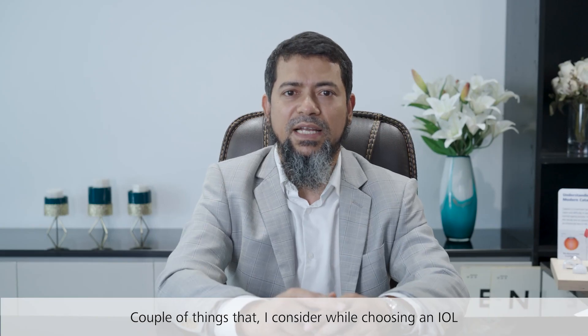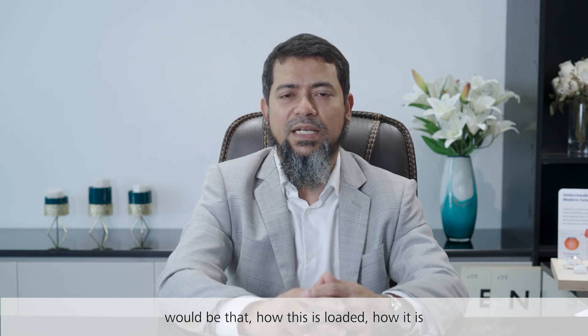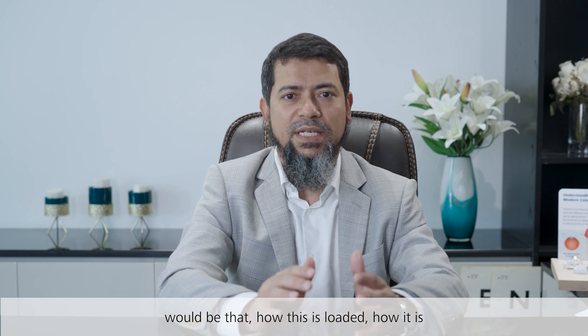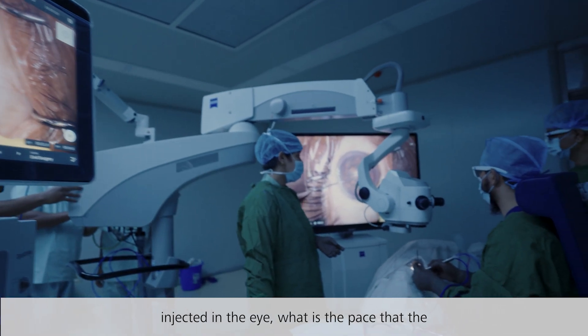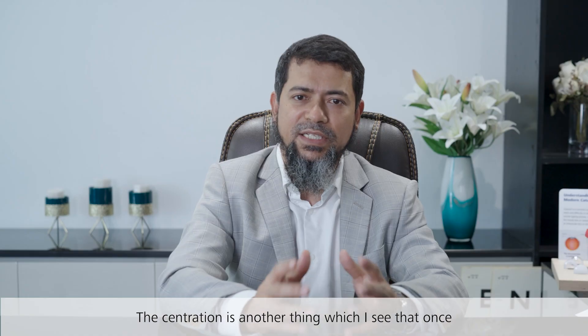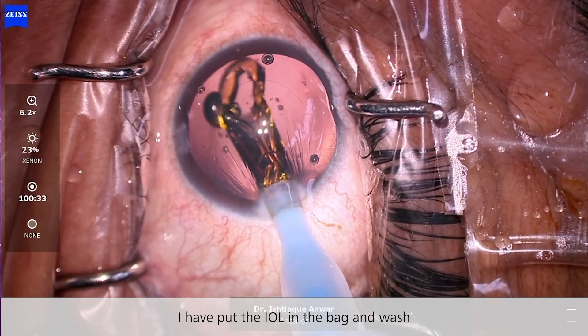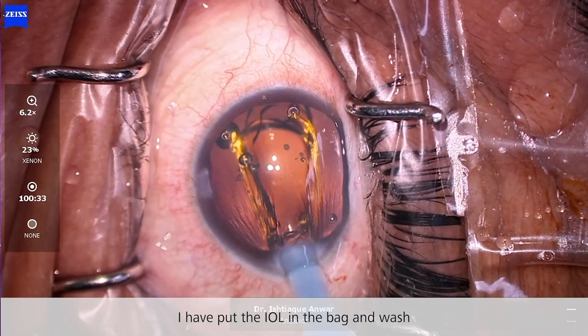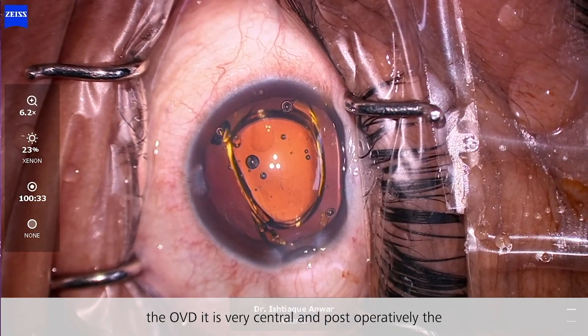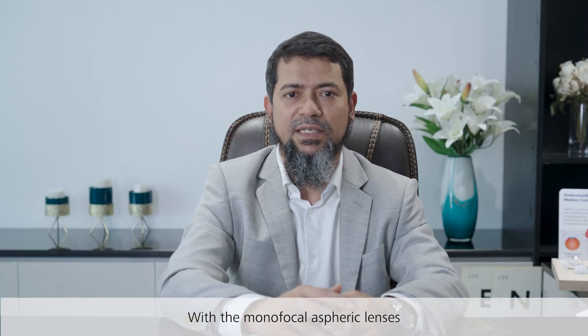A couple of things I consider while choosing an IOL would be: how it is loaded, how it is injected into the eye, and what is the pace at which the lens opens up in the eye. Centration is another thing — once I have put the IOL in and washed the OVD, it is very central, and post-operatively in follow-ups I have seen that it stays in the very center.